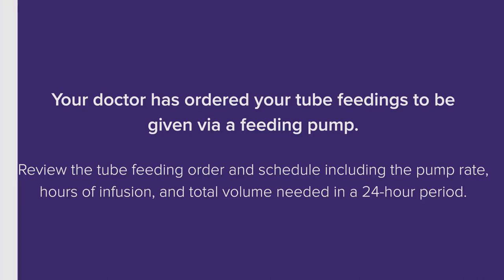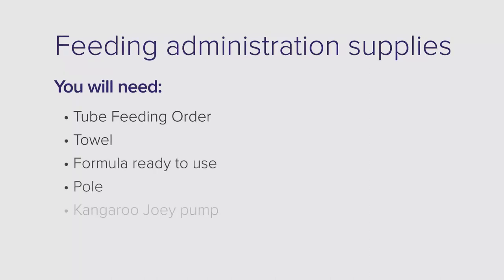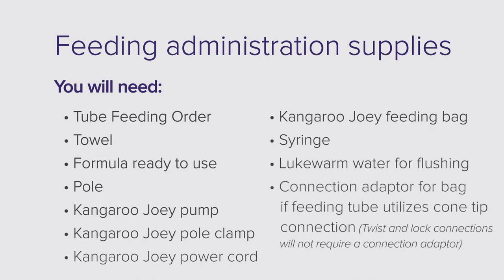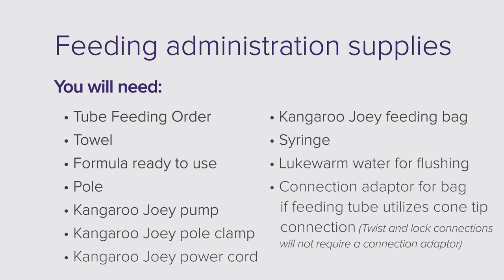For pole-based feeding administration, you will need: the tube feeding order, a towel, formula ready to use, a pole, Kangaroo Joey pump, Kangaroo Joey pole clamp, Kangaroo Joey power cord, Kangaroo Joey feeding bag, a syringe, lukewarm water for flushing, and a connection adapter for the bag if your feeding tube utilizes a cone tip connection. Twist and lock connections will not require a connection adapter.